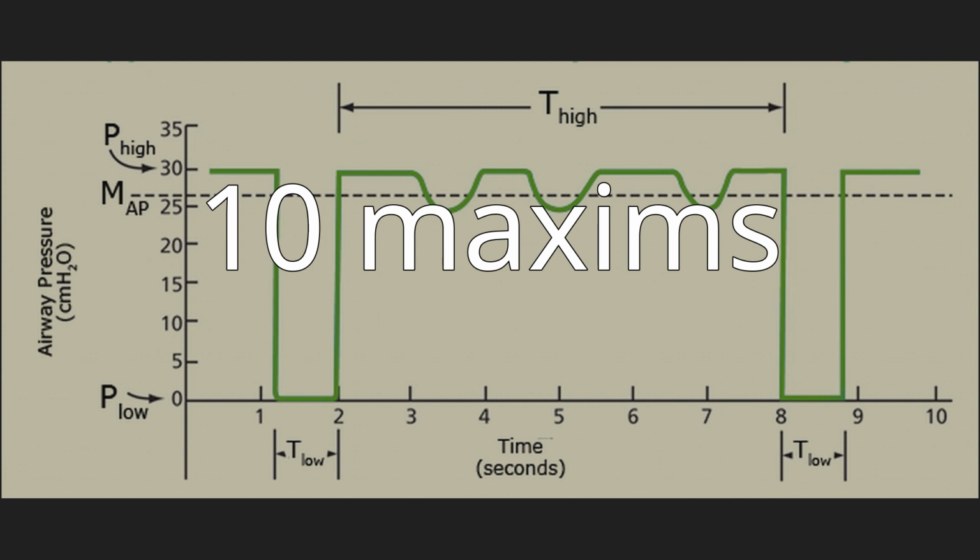A mode of ventilation is classified according to its control variable, breath sequence, and targeting schemes. The preceding 9 maxims create a theoretical foundation for a taxonomy of mechanical ventilation. The taxonomy is based on these theoretical constructs and has 4 hierarchical levels: control variable, pressure or volume for the primary breath; breath sequence, CMV, IMV or CSV; primary breath targeting scheme for CMV or CSV; secondary breath targeting scheme for IMV. The primary breath is either the only breath there is, mandatory for CMV and spontaneous for CSV, or it is the mandatory breath in IMV.